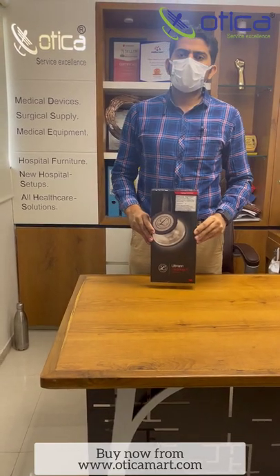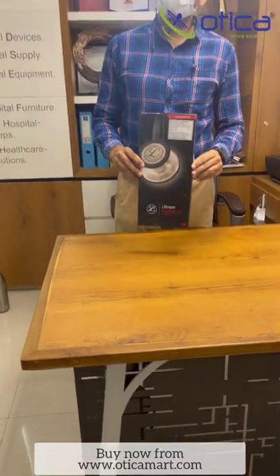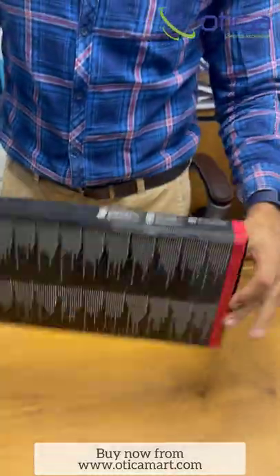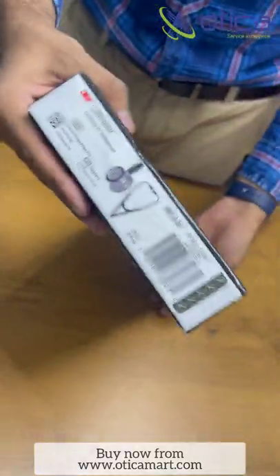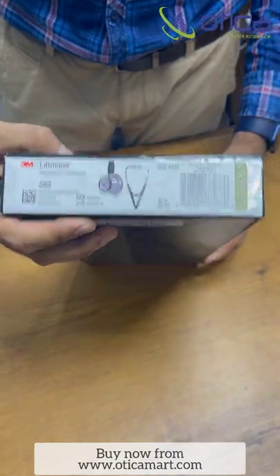Hello friends, welcome to Otcom Meditronics Company. Today we have just purchased the Littmann Cardiology 4 stethoscope from Amazon. You can see the device comes like this — there is no seal provided by the company. You can check the device; this is the MRP, this is the model number 6152, Littmann Cardiology 4.